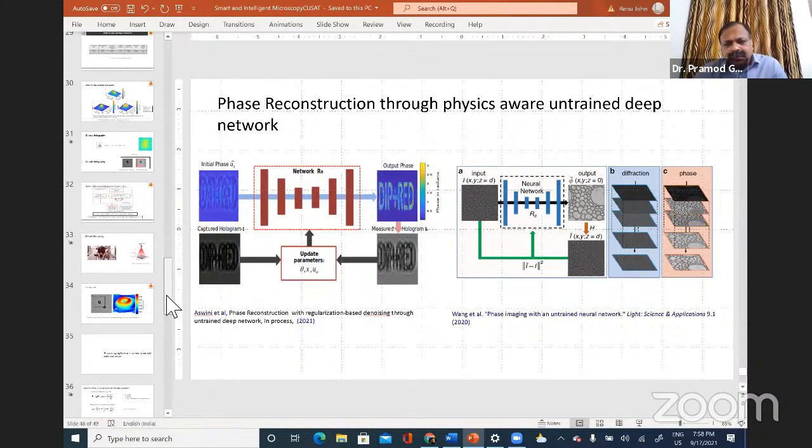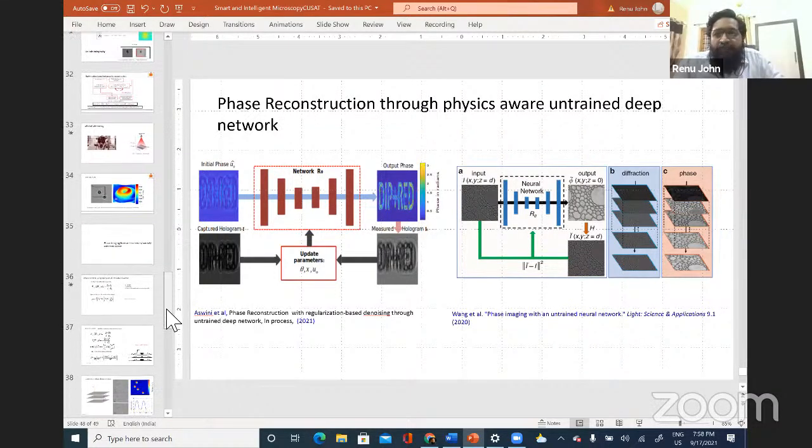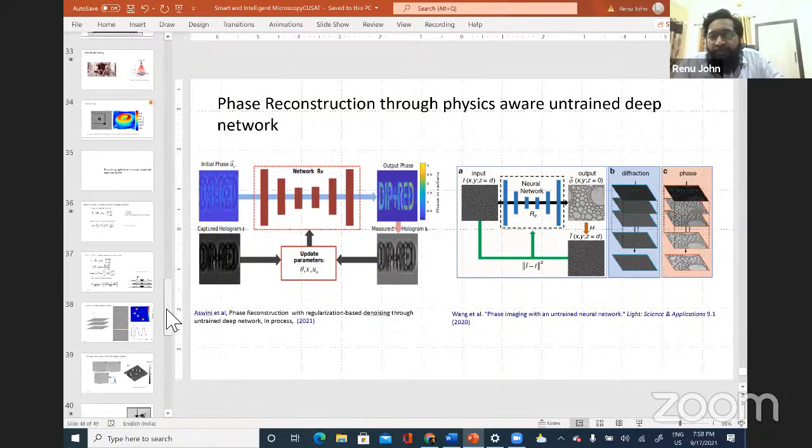So basically, we looked at classification of the pap smear with the cervical cancer cells. We could get up to 98% accuracy with a very low number of samples. As of now we had 17 patients and the number of cells was probably under 10 to the power of 5.